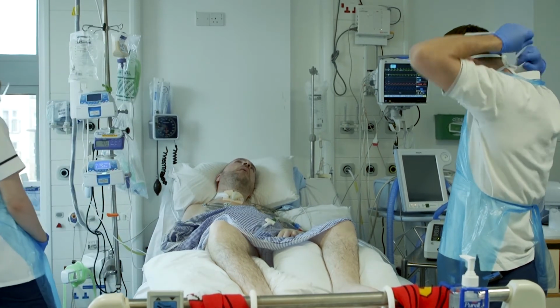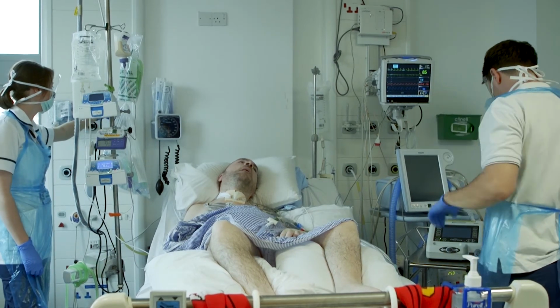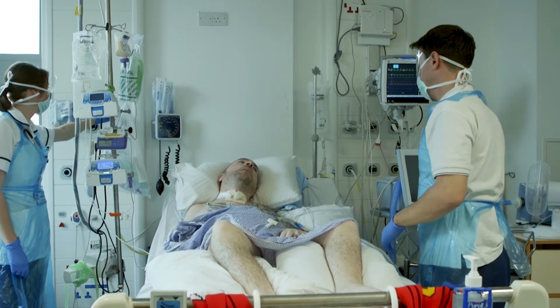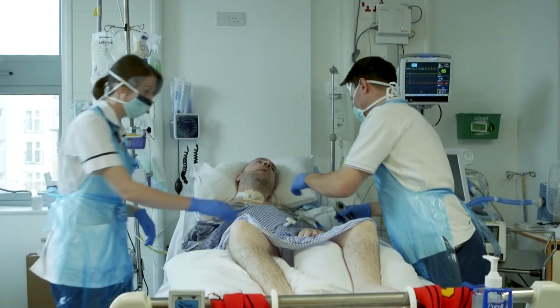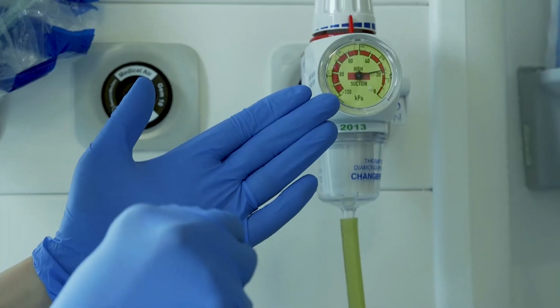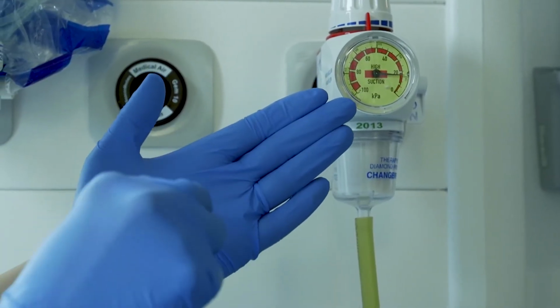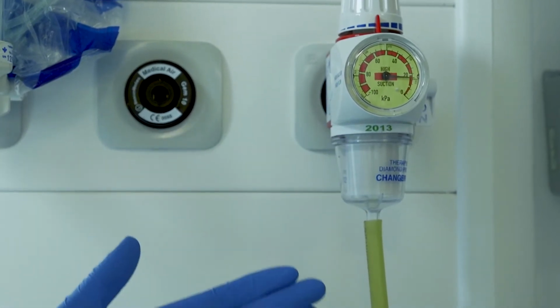Prior to attaching the closed suction mount to the MIE circuit, the physio will check the suction pressure to ensure that it is not higher than 20 kilopascals. We can see here in the video, the physiotherapist is checking the suction against the machine to see what the pressure is reading when suction is applied.